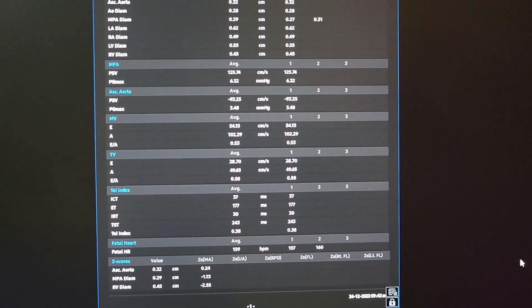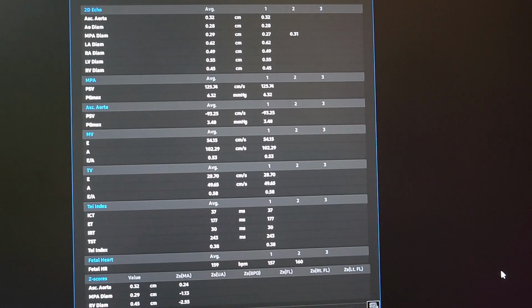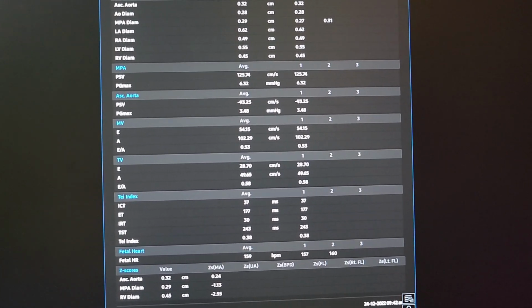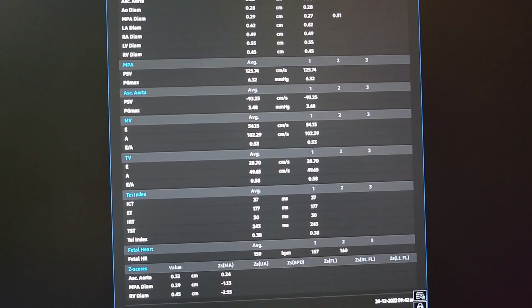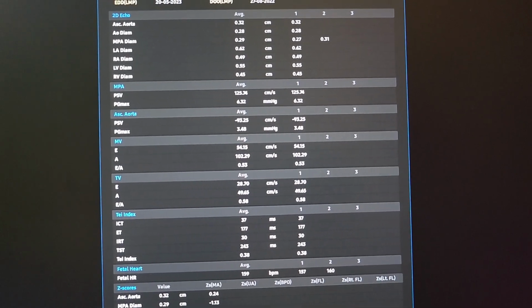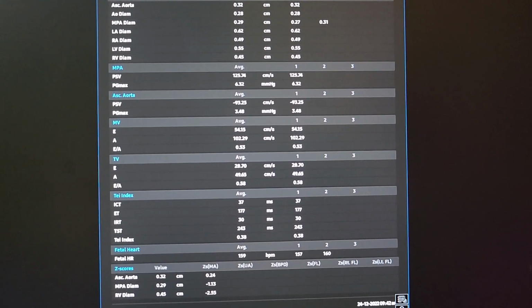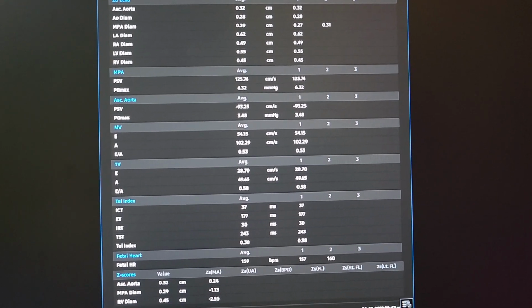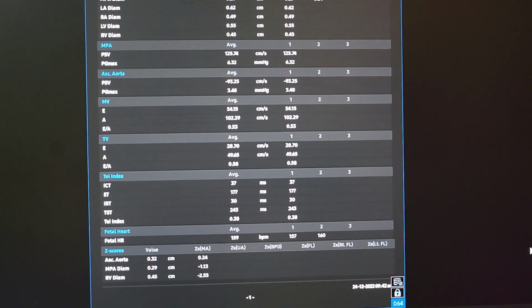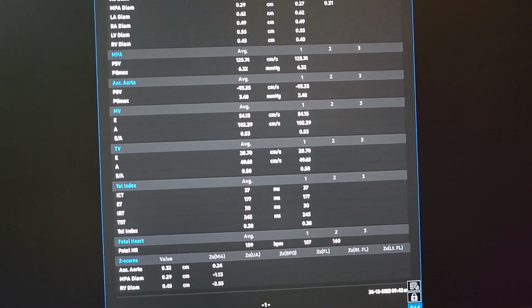So the prognosis in this case will be eventually a single ventricular morphology, and repairs may need to be in multiple stages. The good thing is the ductus arteriosus keeps the pulmonary vasculature open in spite of pulmonary valve atresia. So this is a duct dependent circulation. The bad thing is the echogenic changes in the free ventricular wall, in the ventricular septum, in the tricuspid valve are all evolving abnormal changes of the myocardium, endomyocardium, which may result in failure of the heart to pump well.